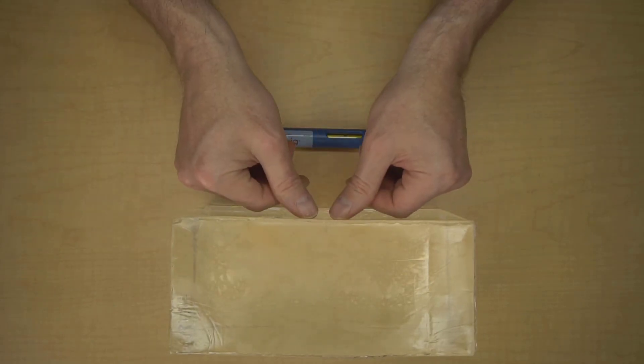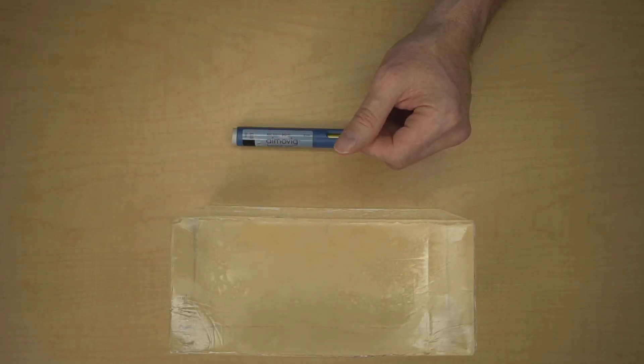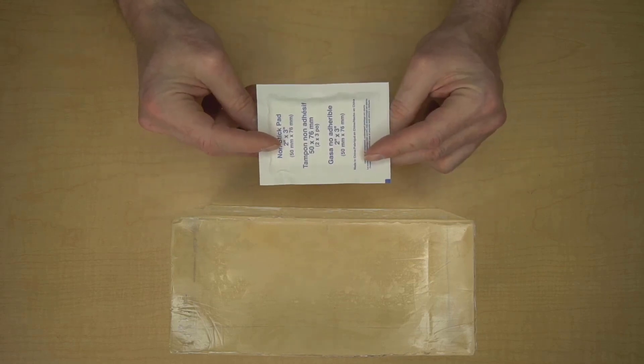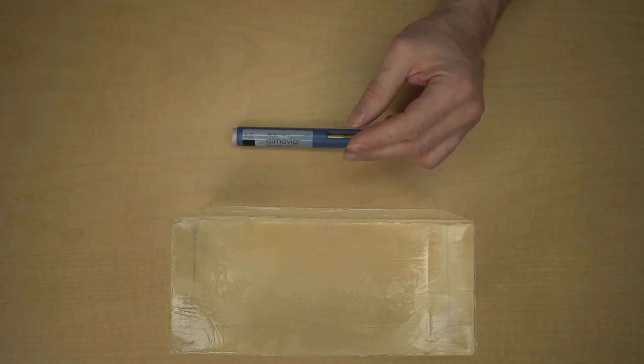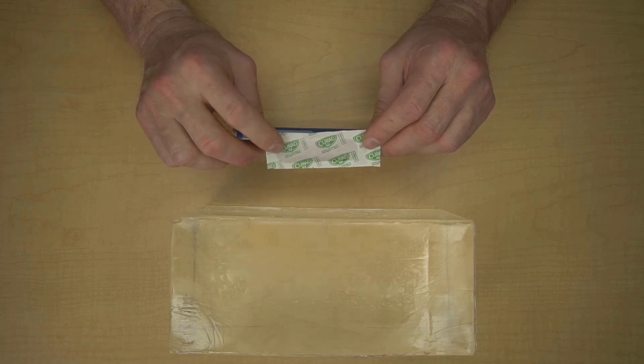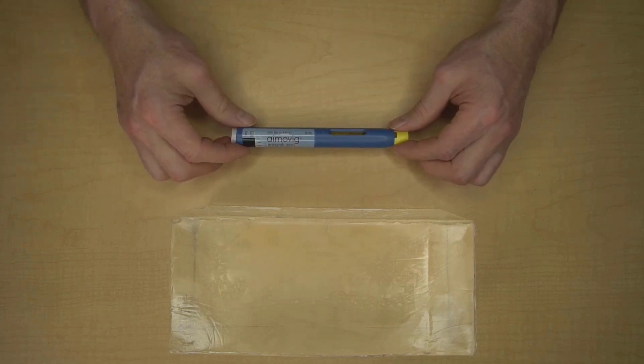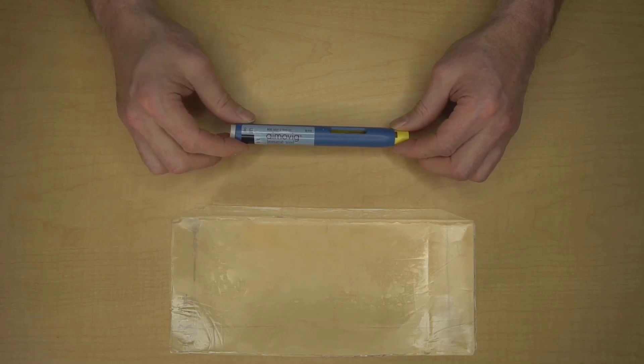After your injection, examine the injection site. If there's blood, you may want to use some gauze and apply a bit of pressure, and if you need to, put a band-aid on it. Dispose of your auto-injector in a sharps container. You can get a sharps container from your pharmacy.